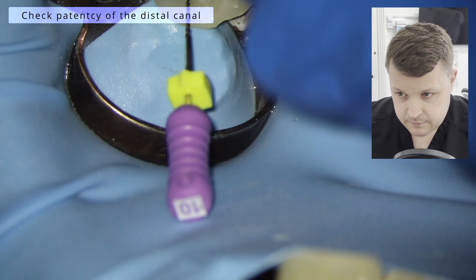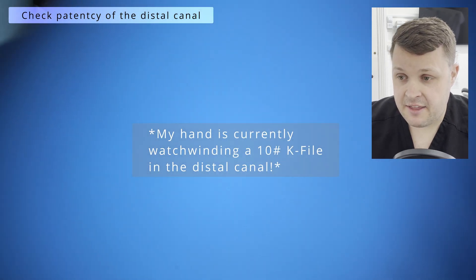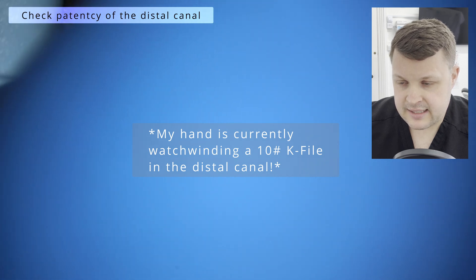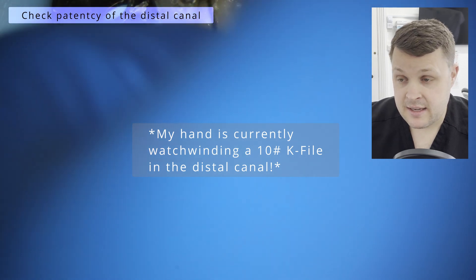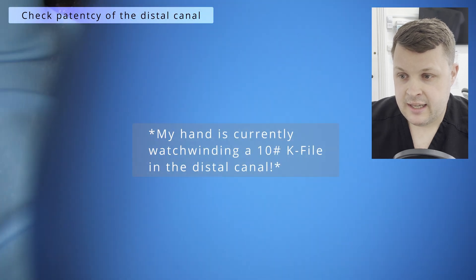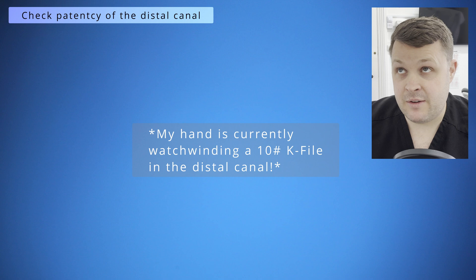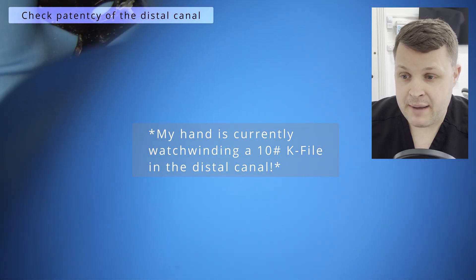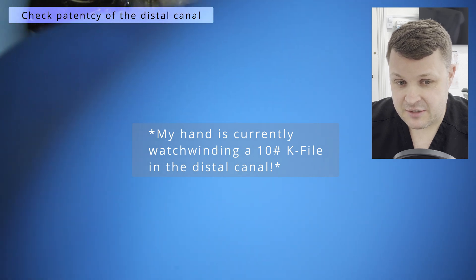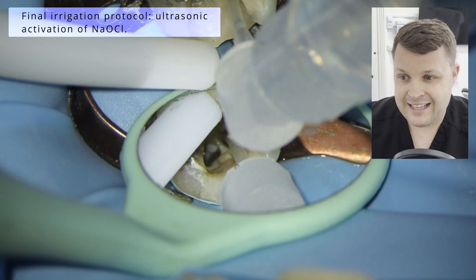We are at the working length, and I suspect in this case there's probably a tight 90-degree bend in the distal canal, which is really, really common. I'm using a size 10 K file to ensure we've got patency from that tight, acute bend. You can't see here, but I'm using a watch-winding slash in-and-out motion just to make sure that distal canal is patent.